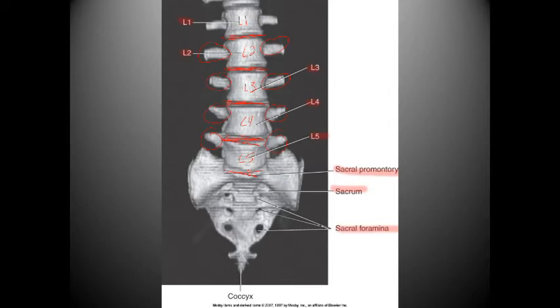Also, one thing that I forgot to mention is that the lumbar spine has 5, but I've seen several instances where you have 6 lumbar vertebrae, and that's usually because one of the areas of the sacrum, S1, has not actually formed with the sacrum correctly, and so it kind of tricks you into thinking that you have that being L5 instead of the true L5. And so the rule of thumb there is I usually just scan all 6 of the lumbar vertebrae, because you're trying to get all of this area. So you want all of that area, or as much as you can get.